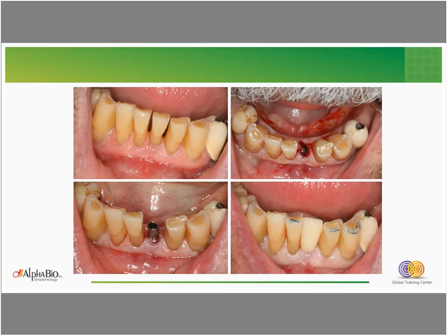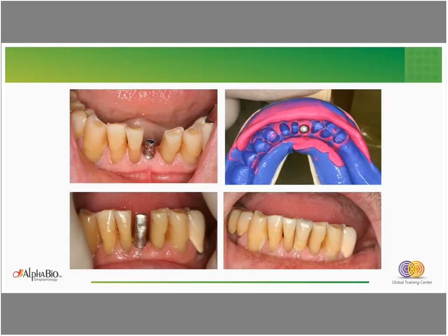And according to this implant, we can also use slim abutments in order to have a good retention and maintenance of the anterior teeth. This is the abutment preparation and the final crown restoration.